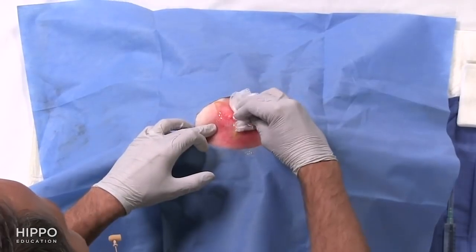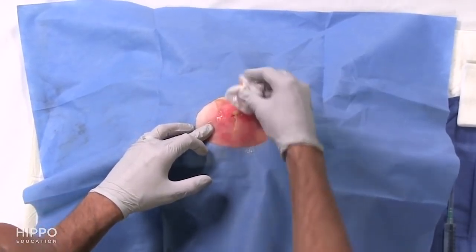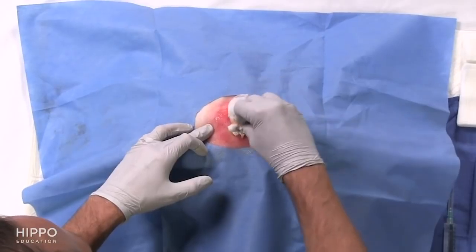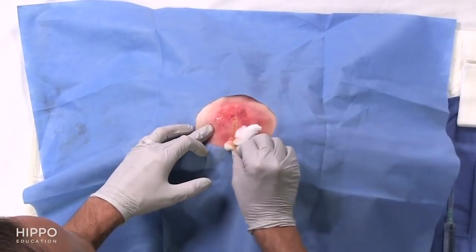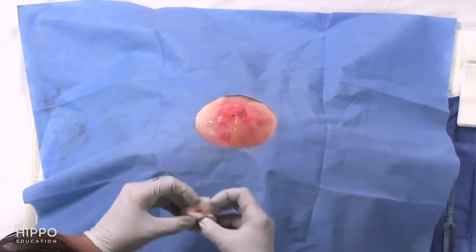Milking the abscess is not really necessary and often causes a lot of pain. But if you want to check how much pus remains, applying a little external pressure is acceptable.